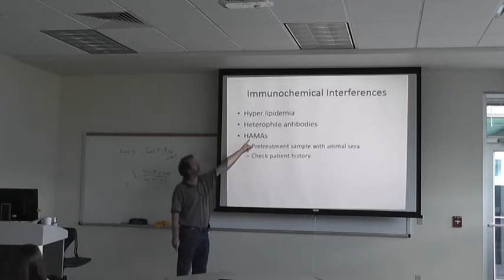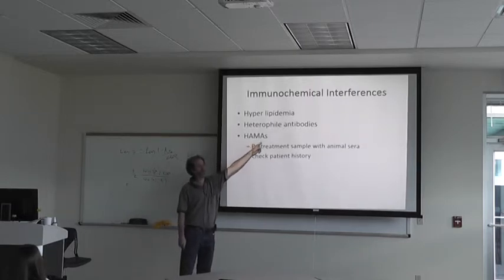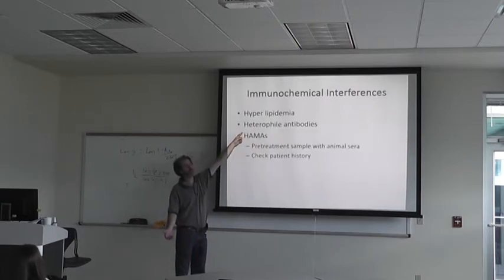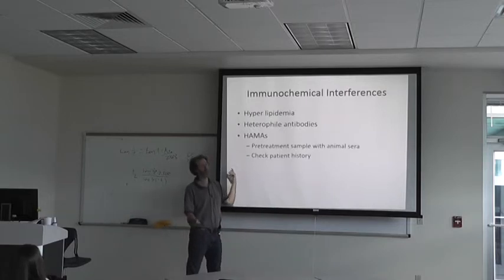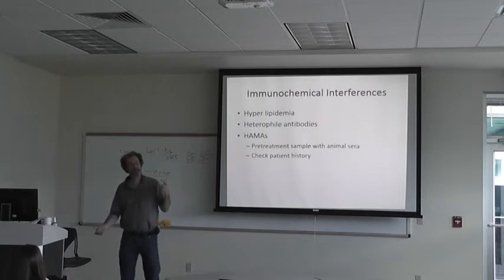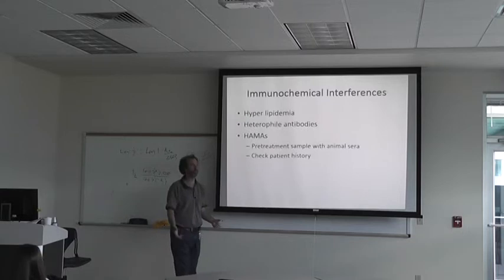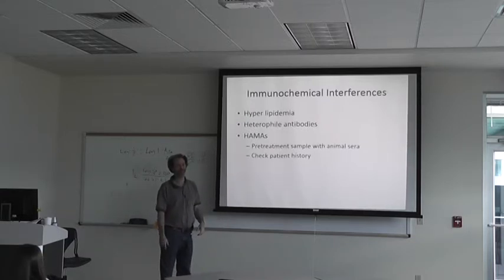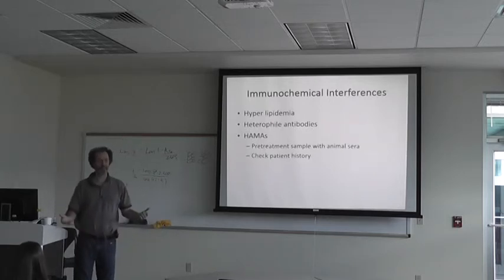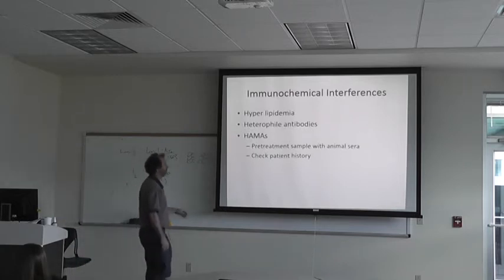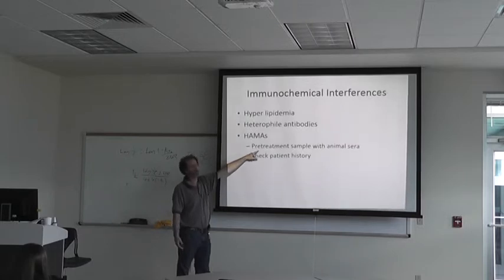HAMA stands for Human Anti-Mouse Antibodies — it's one of the more common heterophile antibodies that interfere. Most primary antibodies are made from mice, so if you have human anti-mouse antibodies in the sample, they're going to interfere with the immunological reaction. They will bind the primary antibody of that system. So typically you want to pre-treat the sample with mouse serum to tie up all the anti-mouse antibodies first.